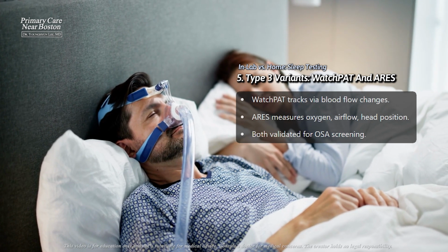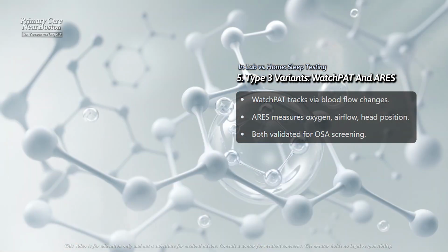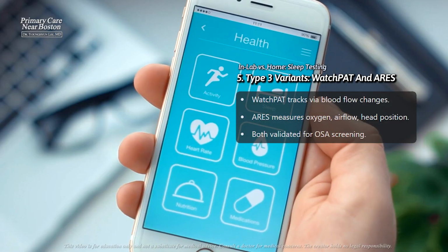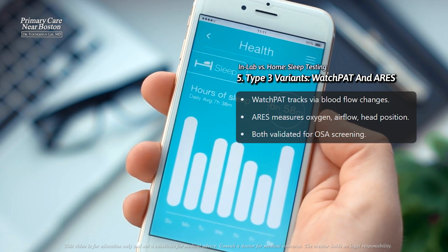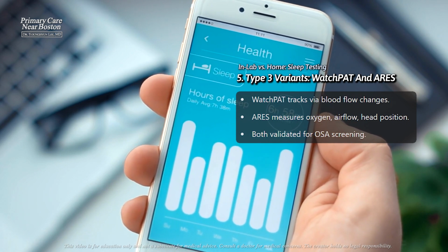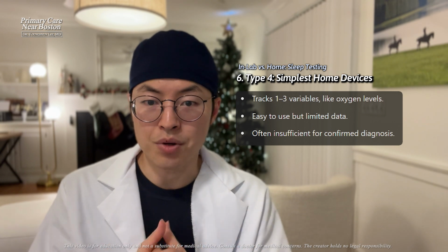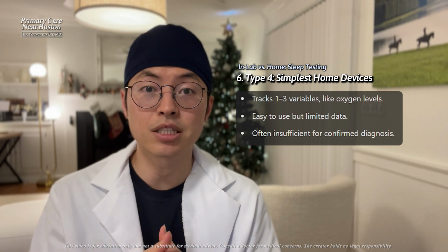The Apnea Risk Evaluation System, ARES, is another head-worn device that measures oxygen saturation, airflow, and head position. Both WatchPAT and ARES have software to interpret results and calculate indices for breathing disturbances. Type 4 devices are simpler and track 1 to 3 variables, typically oxygen levels and airflow, to assess breathing disruptions.